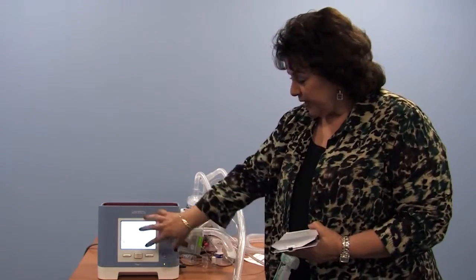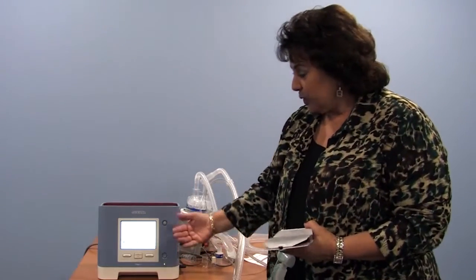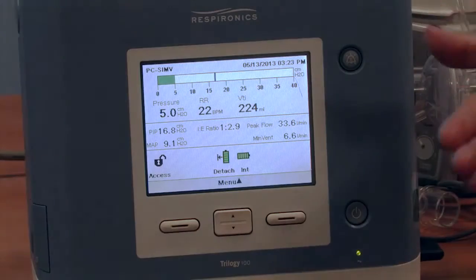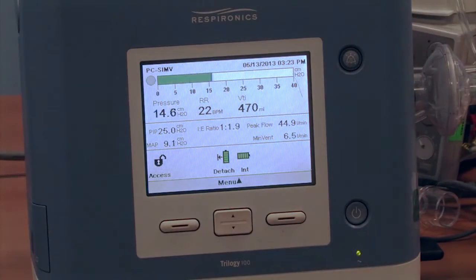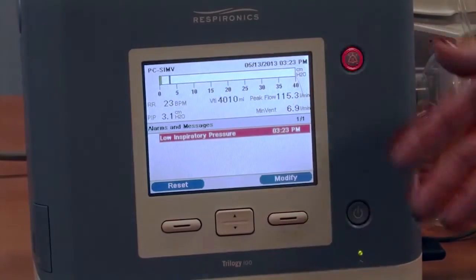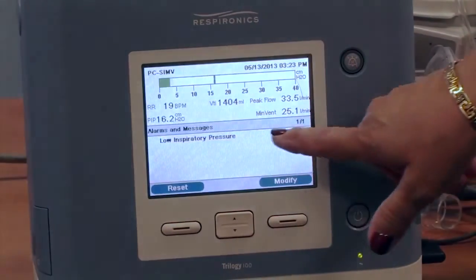The machine will certainly, as we just demonstrated, show you if we are on the internal batteries for any reason. And will, like I showed you, show the yellow low priority alarm that shows up here and also in the window. So you might say to me, well, what about if my patient comes disconnected off the machine? What's going to happen? So now you see a red alarm, low inspiratory pressure.